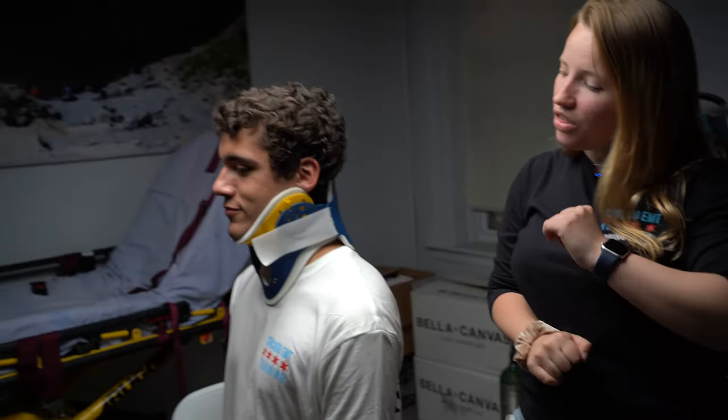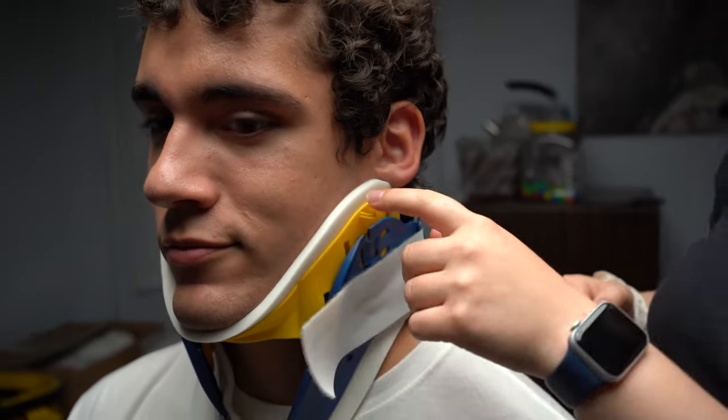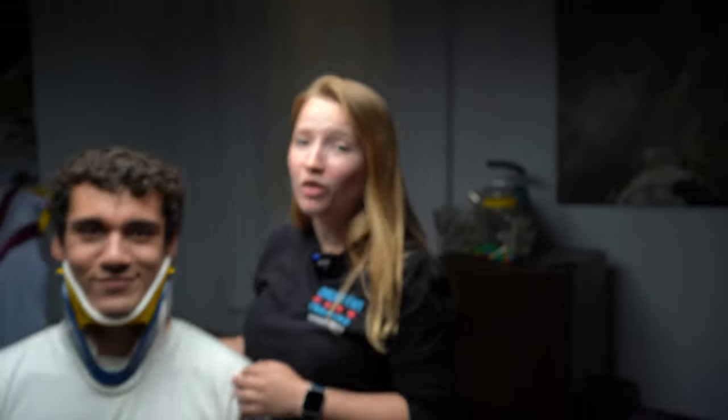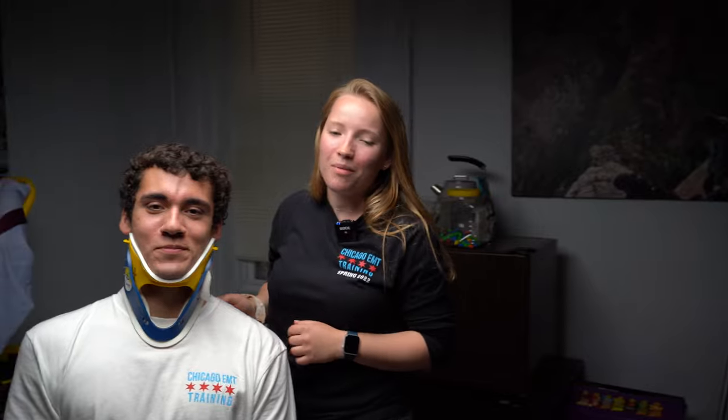The last little thing: these yellow hooks right here on the collar — you can put the nasal cannula there using these little clips. And that's the C-collar. Thank you for being a great patient, Diego. If you have any questions, just leave them in the comments — we're happy to help.